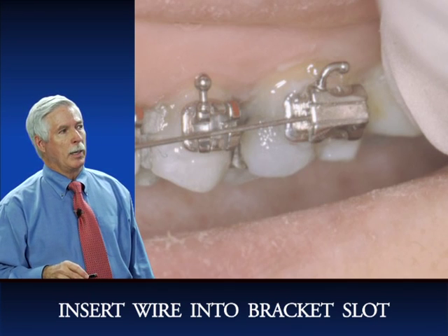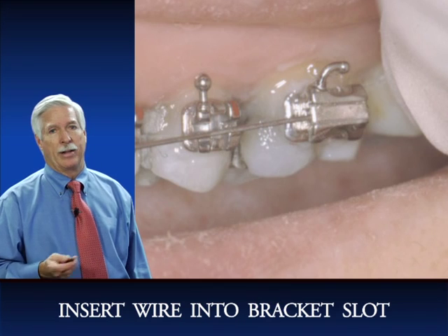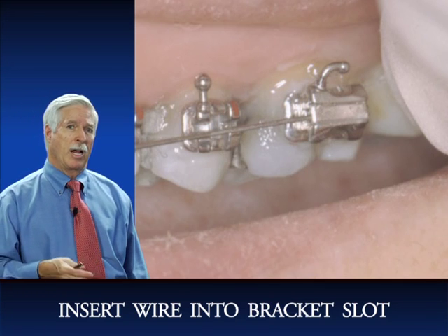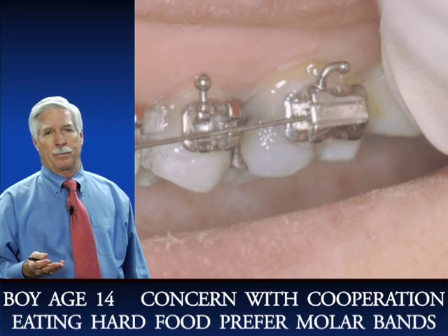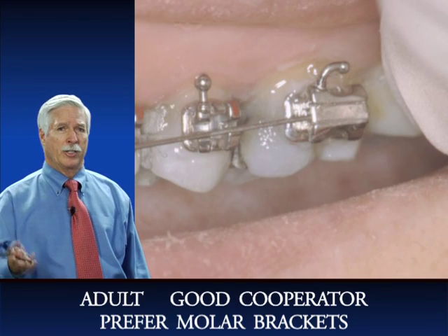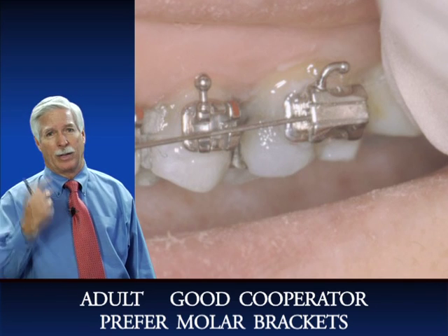Now, we usually don't place the molar bands or brackets until the next appointment. If we're placing brackets on the molar, this is not this case because she got bands placed, but if you're going to put a molar bracket, you can go all the way back. And actually, a lot of patients now are preferring brackets to bands. So if it's a boy and I'm concerned about his cooperation and eating hard foods, then I'll always put a band. But if it's an adult and she's very cooperative and will follow instructions correctly, then you can certainly put a bracket.